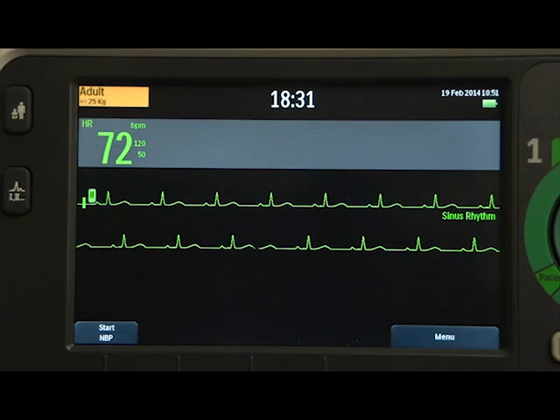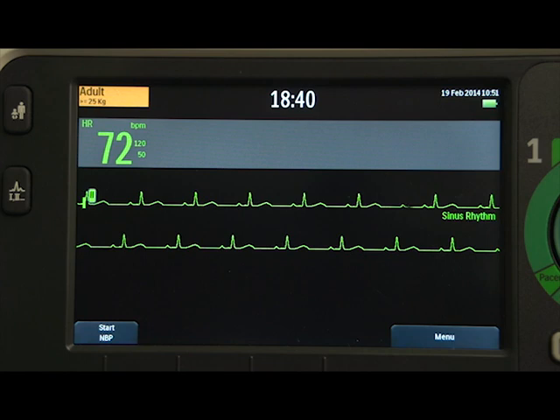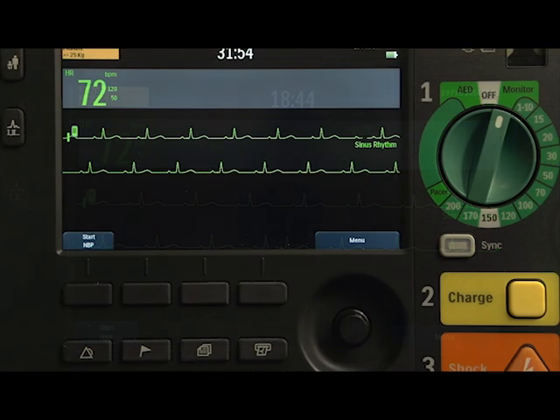The DFM100 uses the STAR arrhythmia algorithm for monitoring arrhythmia. Arrhythmia analysis provides information on your patient's condition, including heart rate and arrhythmia alarms. It uses the ECG lead appearing in Wave Sector 1 for single-lead arrhythmia analysis.